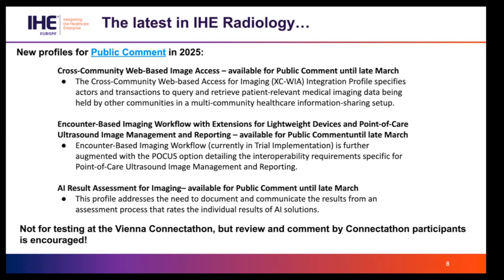The other profile is actually not a profile by itself, but more of an extension of the profile currently in trial implementation, which is encounter-based imaging workflow, but it extends significantly that profile to support the point-of-care ultrasound option.